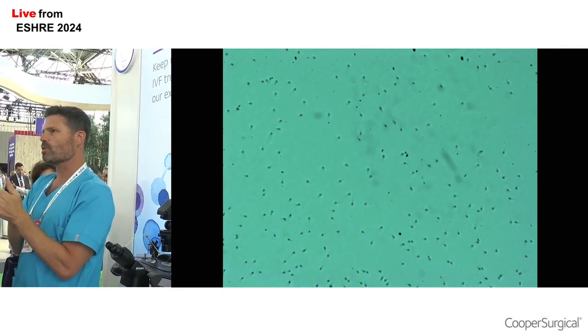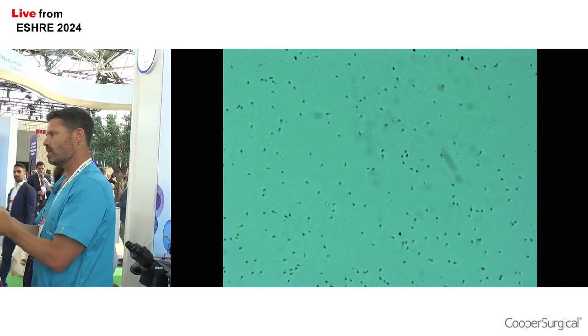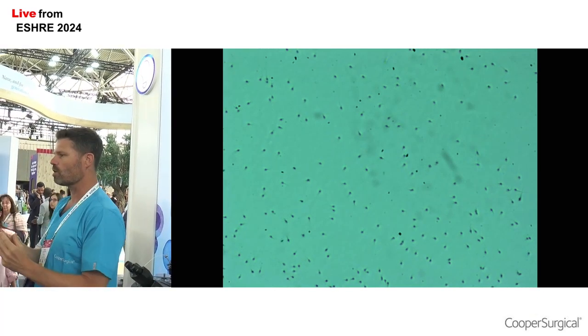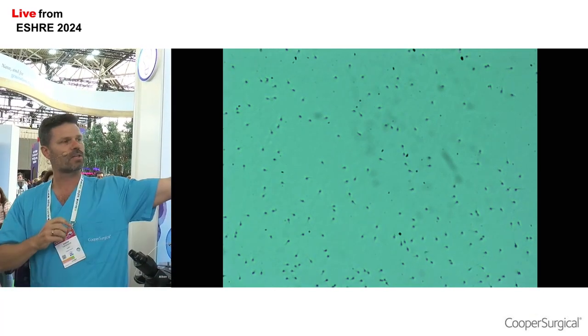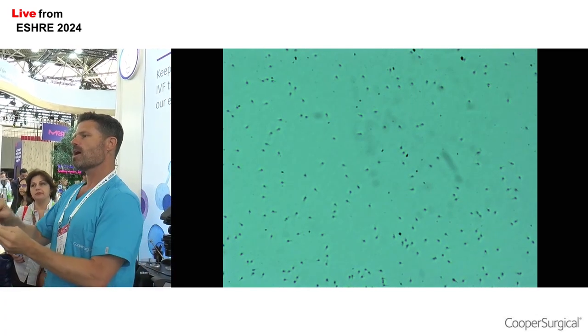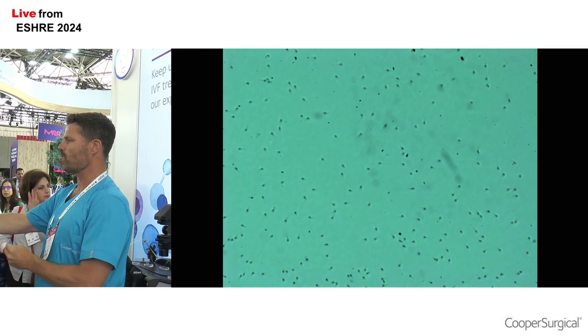So I'll go first with my ICSI pipette into the PVP drop. I'll load PVP into my ICSI pipette so you have a good control. Then I'm going to go into this drop where the hyaluronic acid is. I'm going to select a sperm which is bound. I'm going to take that sperm back into my PVP drop.